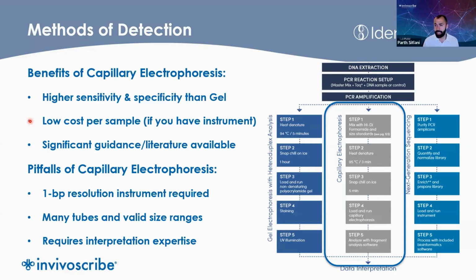We are investigating some of the other third-party instruments from brands like Promega and Qiagen. We will have some data for those hopefully in the near future.